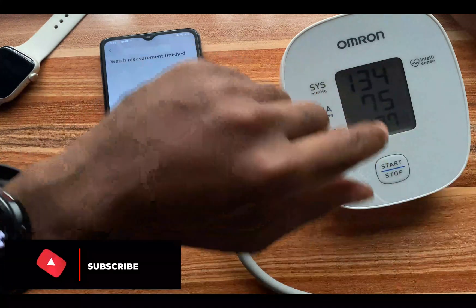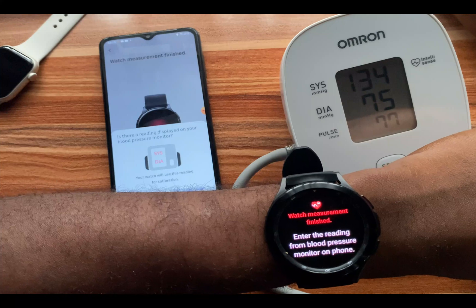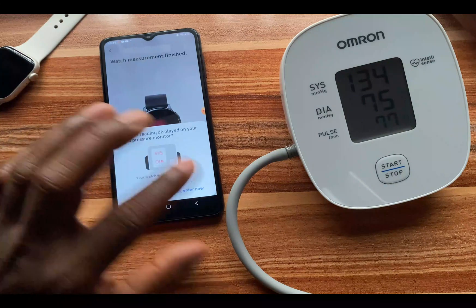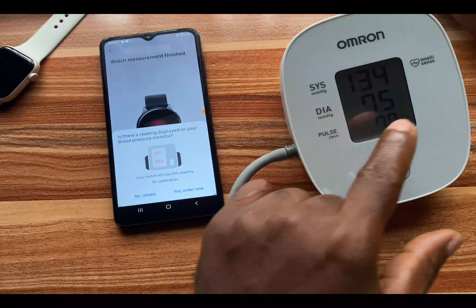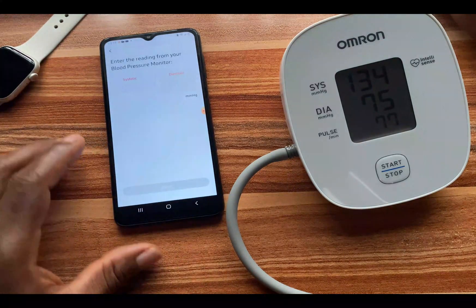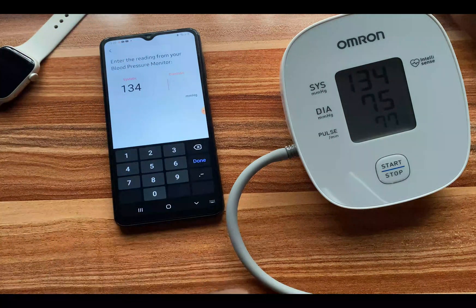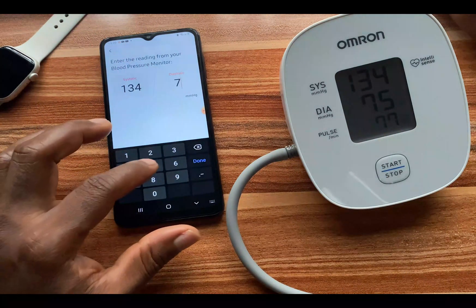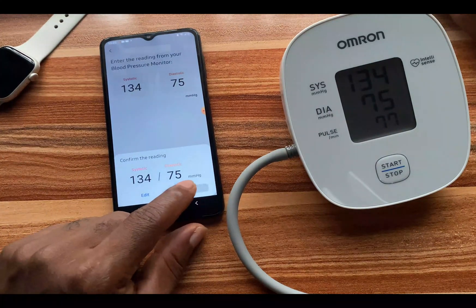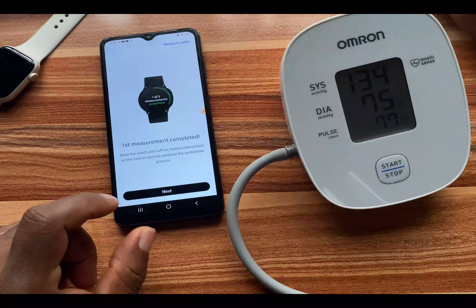The watch measurement has finished. It says 'Enter the readings from the blood pressure monitor on the phone.' I'm going to enter the readings now. We have the systolic, which is the upper number, and the diastolic, which is the lower number. The systolic is 134 — that's quite high — and the diastolic is 75. I'll tap 'Done' and then confirm. First measurement completed.